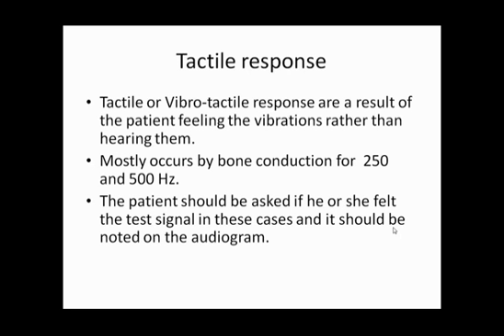Tactile or vibrotactile responses are a result of the patient feeling the vibrations rather than hearing them. This mostly occurs by bone conduction for 250 and 500 hertz.